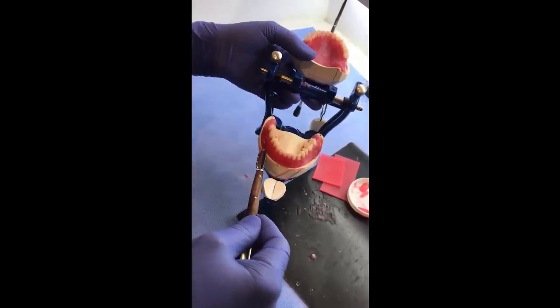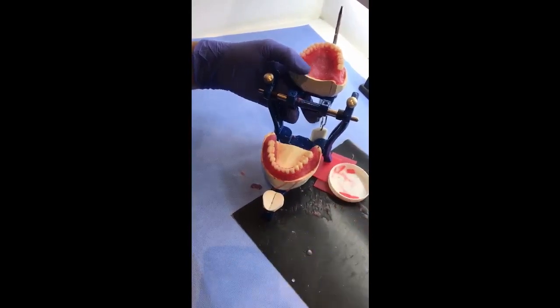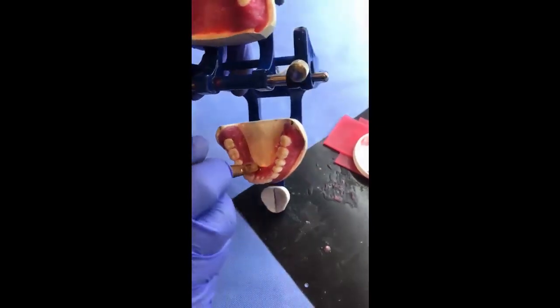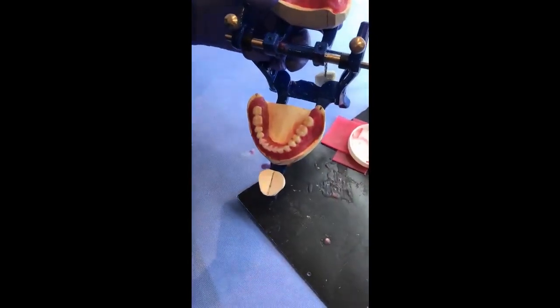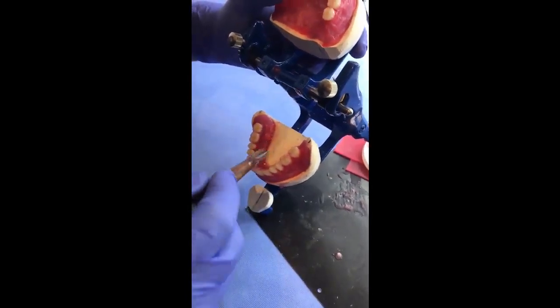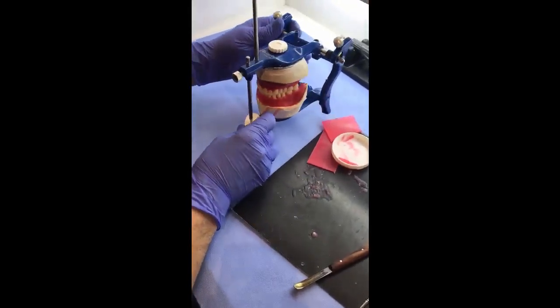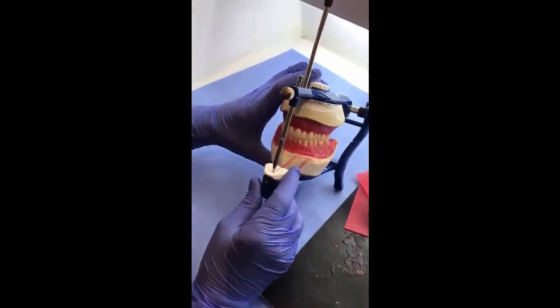As you see, we use hot wax to seal the sulcus all around. Now we have the lingual sulcus. We try to keep the wax just around the base plate, record base. Now the models and the record bases are sealed together. We are going to proceed now to the waxing up of the trial denture.